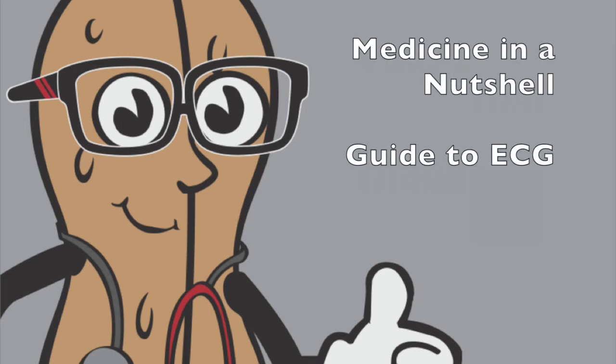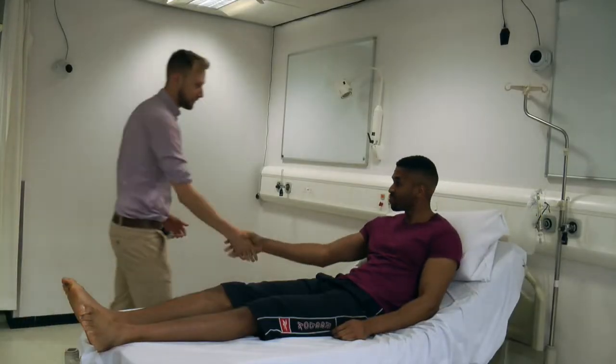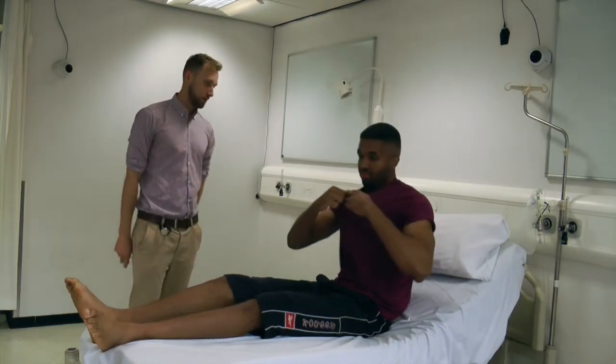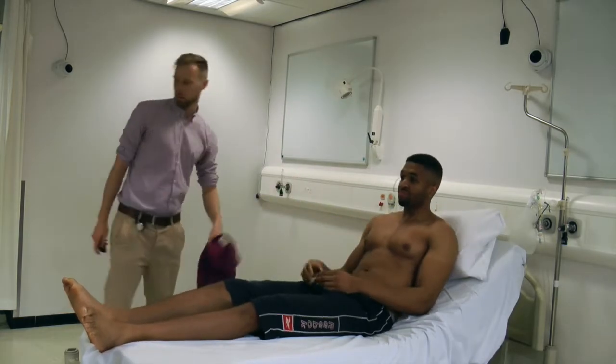Welcome to Medicine in Nutshell's guide to taking an ECG. Gain informed consent and explain the procedure fully. Position the patient comfortably in bed and ask them to remove their shirt and bra if they are wearing one. Maintain privacy and dignity — a chaperone may be required.